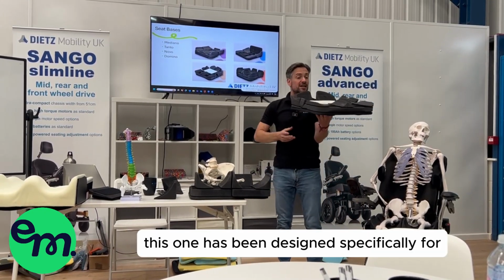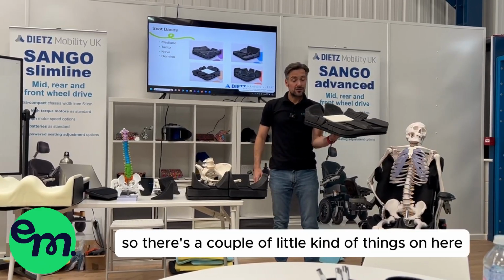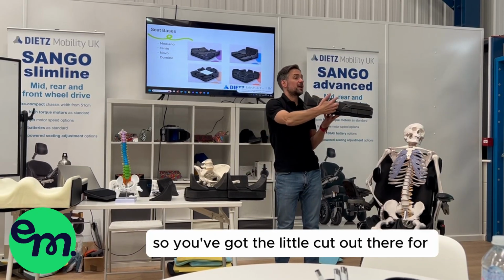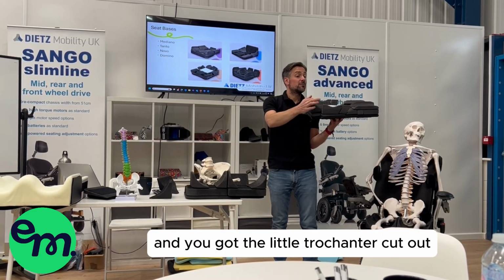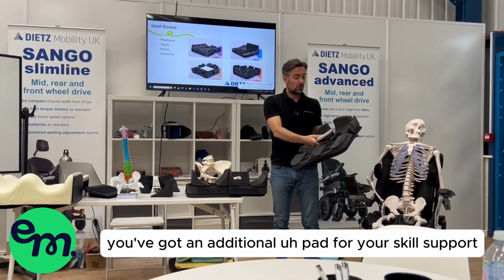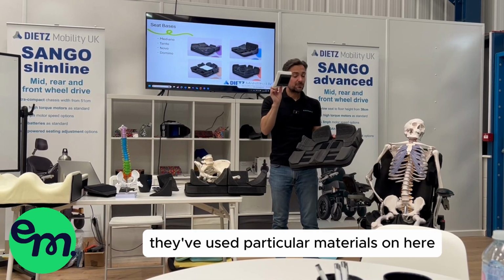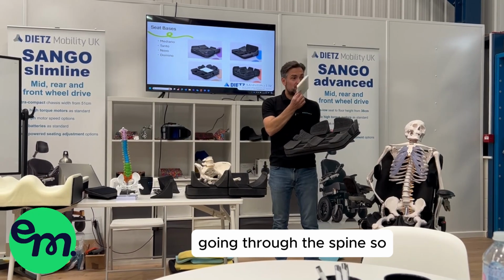This one has been designed specifically for spinal injury users. So there's a couple of little things on here in the design. You've got the little cutout there for the trochanter. So if you've got someone who's atrophied quite heavily, you've got the little trochanter cutout. You've got an additional pad for ischial support. They've used particular materials on here to reduce the amount of vibrations going through the spine.